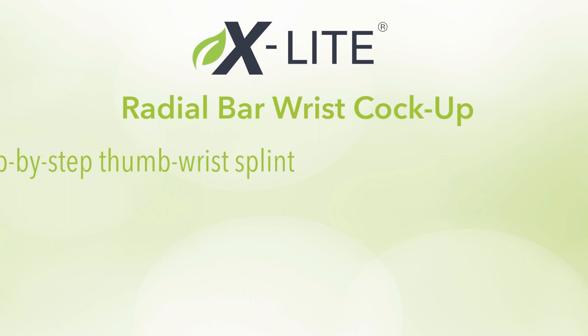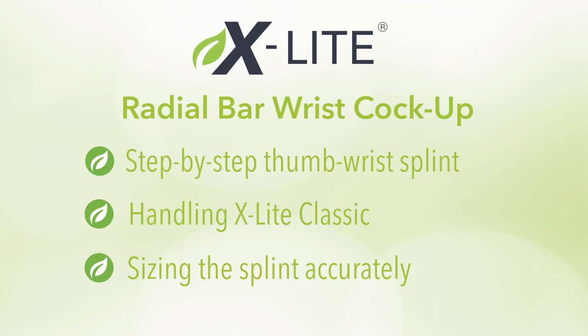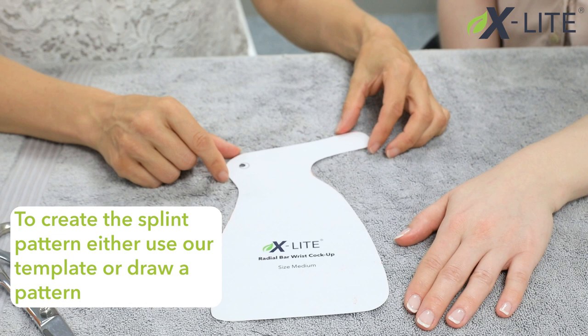In this tutorial we will be showing you how to fabricate a radial bar wrist cock-up using X-Lite Classic. To create the splint, either use our template or draw a pattern.